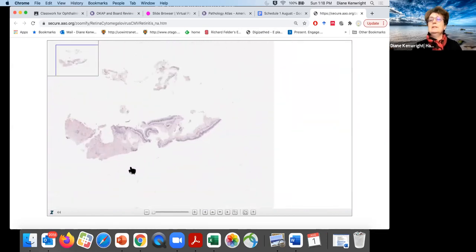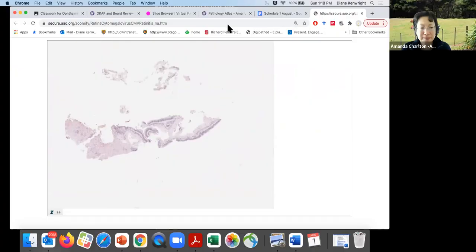I think this is a very rapid kind of look at this. So should we just have 2 minutes with this one? Yep. Okay, breakout groups, off we go. So that's a Cowdry A. Someone's asking. Yes, that is a Cowdry A.